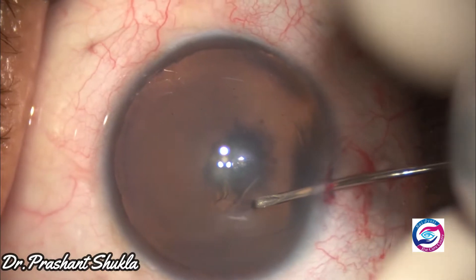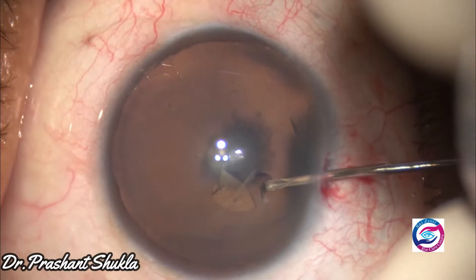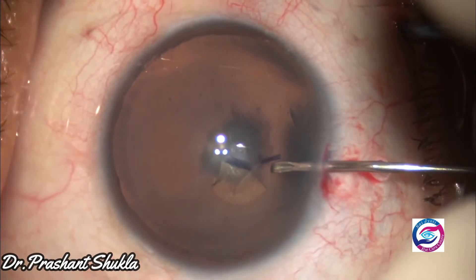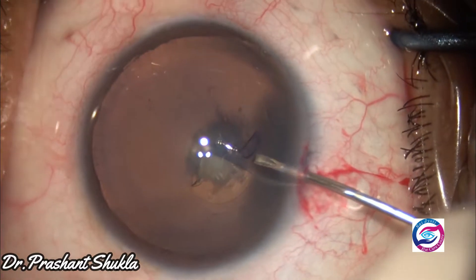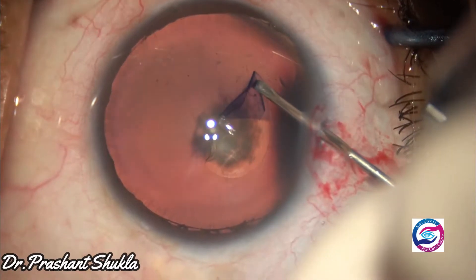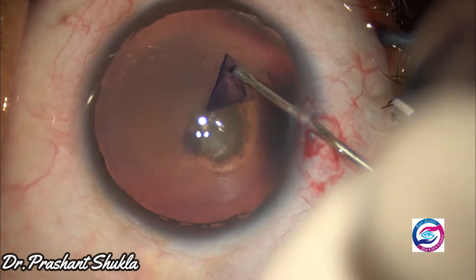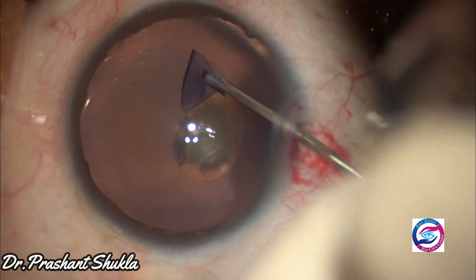By this time one side port has been made and the anterior capsule has been stained with trypan blue dye. The patient is a young patient of about 38 years of age. Rhexis has been initiated with the help of a 26 gauge bent needle cystitome and the anterior capsular flap is being moved slowly.